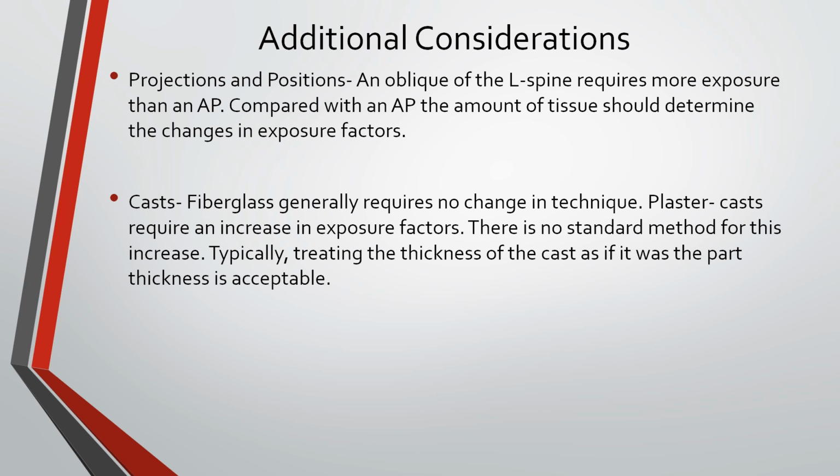Cast fiberglass generally requires no change in technique if the patient has a fiberglass cast on. Plaster casts require an increase in exposure factors. We need to increase when there's plaster. There is no standard method for this increase. Typically, treating the thickness of the cast as if it were part of the thickness of the part is acceptable.